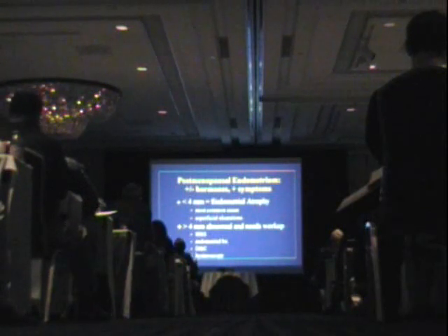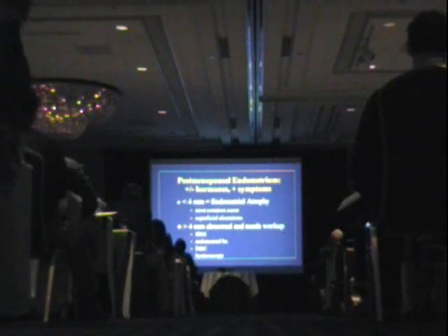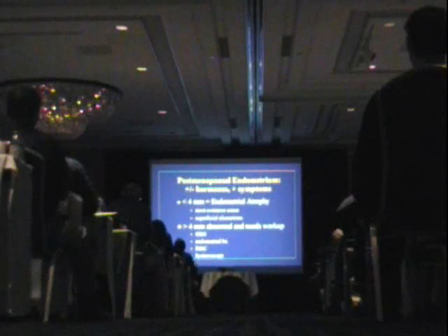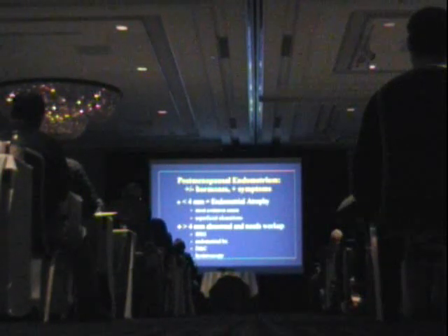Even because the bleeding is happening when it's not supposed to happen. Again, less than 4 millimeters, the patient does not need to have intervention. It's not normal anymore because now the patient's bleeding, but you don't need to intervene. Typically that is due to superficial ulceration or endometrial atrophy, and the clinician may decide to treat the patient with hormones to sort of toughen up or thicken up the endometrial lining.